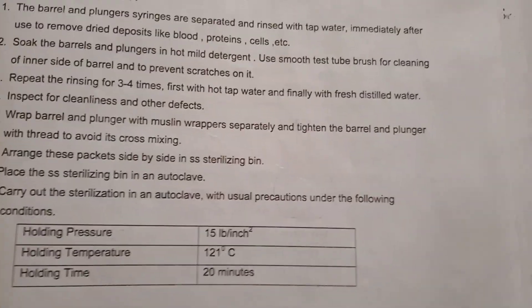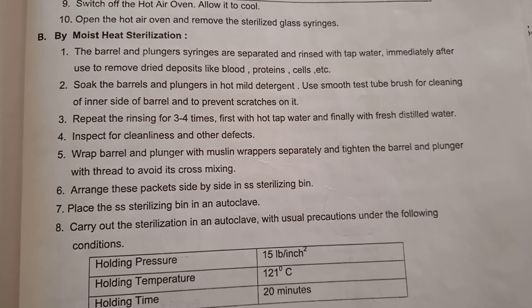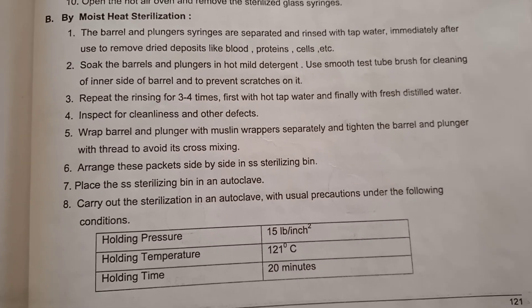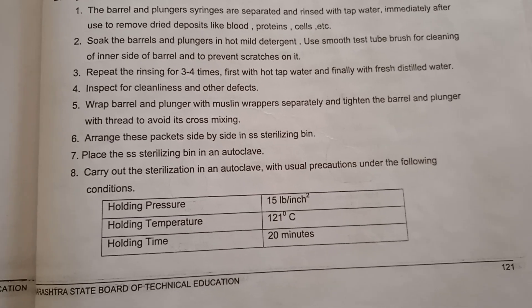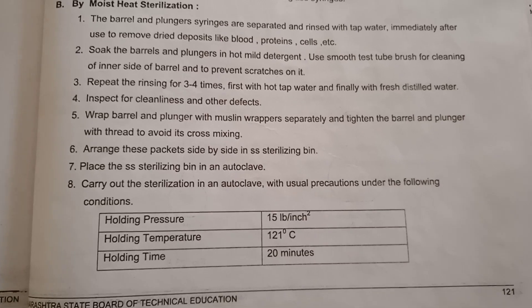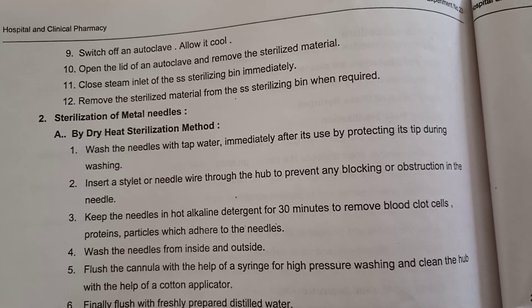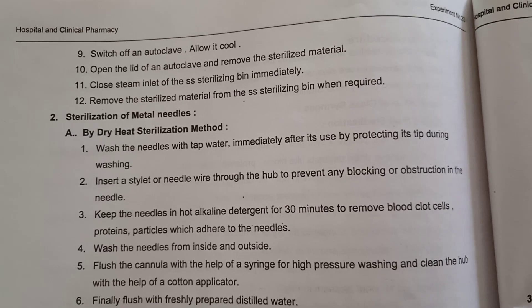The second method is moist heat sterilization. In moist heat sterilization, we use an autoclave. The cleaning procedure is the same for the syringes. After cleaning and drying, wrap the plunger and barrel with muslin wrappers and tie with thread to avoid mixing. Arrange the packets side by side in the SS sterilizing drum. Place the sterilizing drum in the autoclave and sterilize at 121 degrees Celsius for 20 minutes at 15 pounds per square inch pressure. After sterilization, switch off the autoclave and allow it to cool. Open the lid, remove the sterilized material, and close the steam inlet of the SS sterilizing drum immediately. Remove the sterilized material from the drum whenever required.